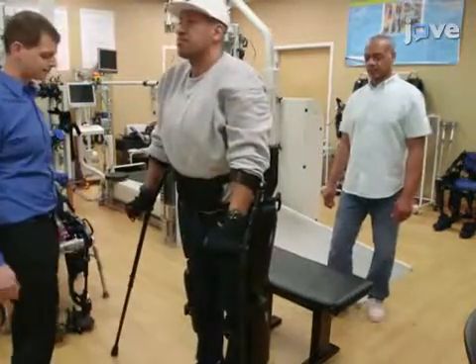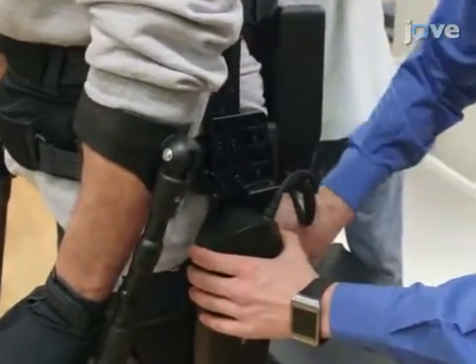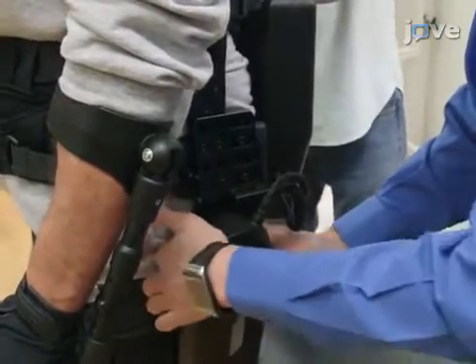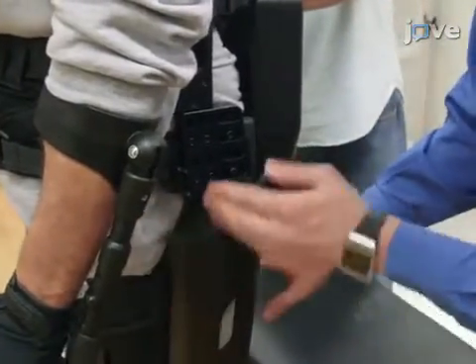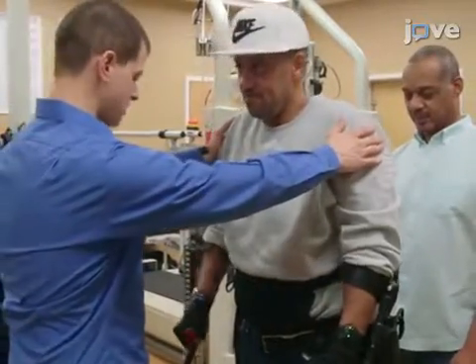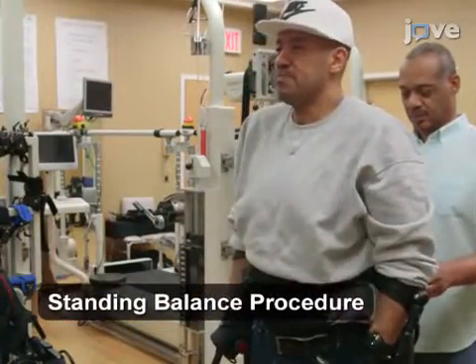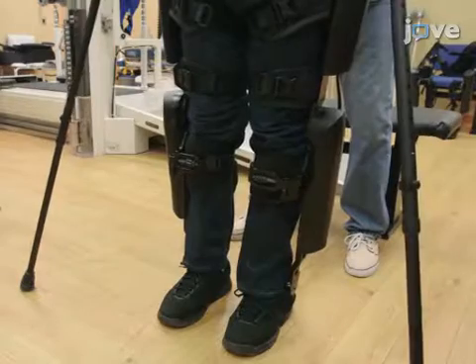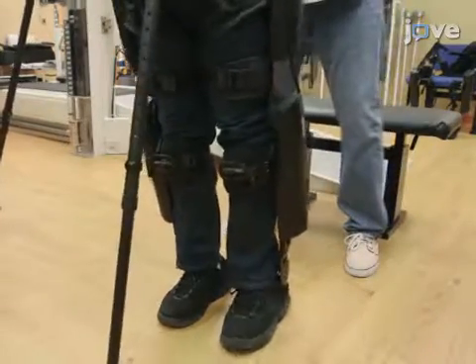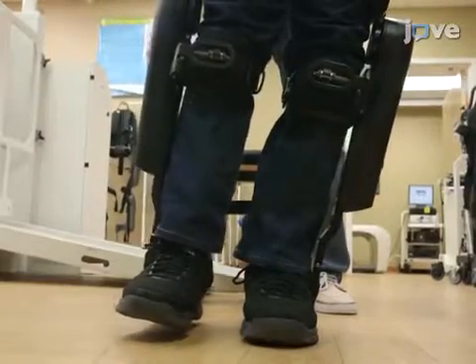During the first occasions of standing, assess if the pelvic band needs adjustment in the front and back. Position appropriately so that the trochanter is in line with the rotation of the hip joint. Ensure the participant is capable of balancing while standing by asking them to demonstrate the ability to stand in the home position using both crutches to maintain balance. Then ask the participant to practice slight shifting of their weight laterally and posteriorly to understand the location and feel of the home position.